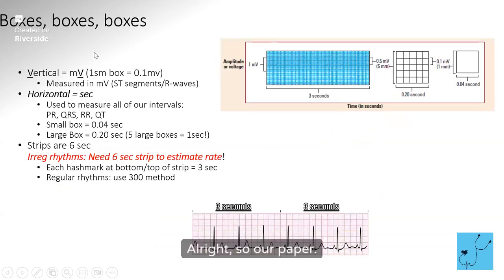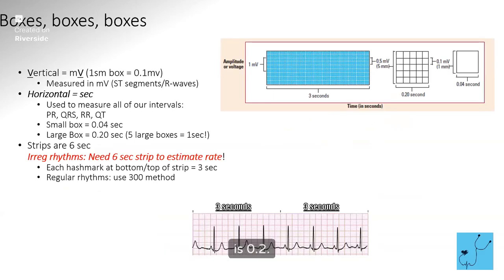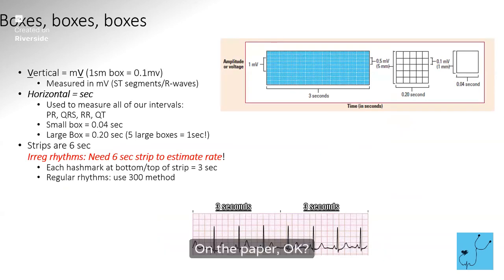All right, so our paper is in seconds, right? Our smallest box is 0.04 seconds, and our big boxes that have the bold lines are 0.2. And then we have little hash marks on the paper. These little hash marks are 3 seconds on the paper.